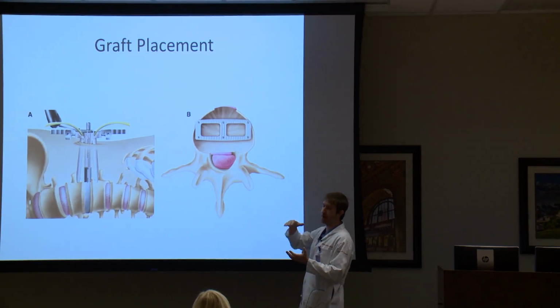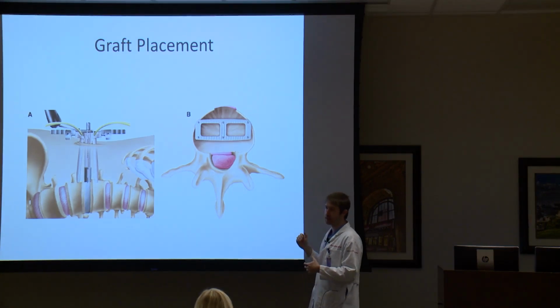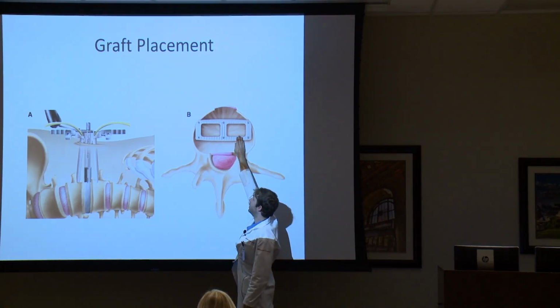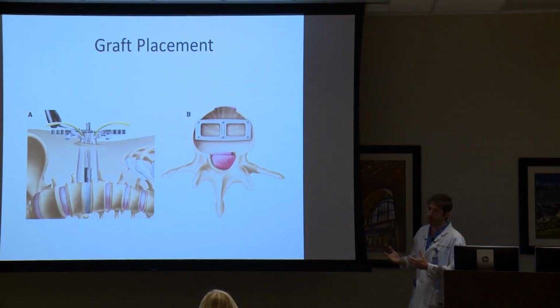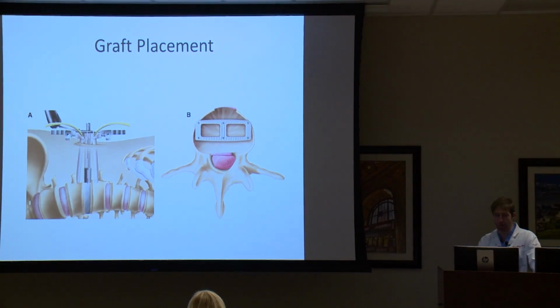You can also imagine that if I have an angle or a wedge, I can easily open things up and give the patient more curve. That's really important, whereas in the back, you just typically get a little tiny cage in. It's probably about the size of my hand in comparison, and you won't get any curve whatsoever. You'll help with fusion mass, but nothing like that. That's money right there. As far as earlier when we were talking about those pillows becoming pancakes, you can really prop them back open, and they can do quite well.